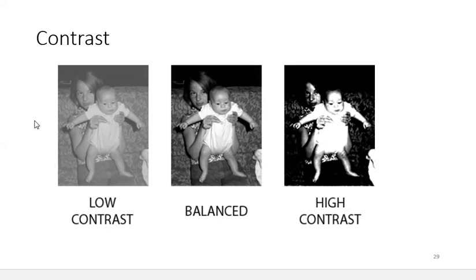So we say contrast, high contrast is an image quality factor, and it is, but it can't be too high contrast. You can't shoot all your bony tissue at 40 kVp, because your contrast would be so high that you could burn out the soft tissue detail that you need to see, so that all you see is bone and not soft tissue. And that's kind of what we have going on over here. The subject contrast is too high, so we need a balance between high contrast and contrast that's not too high.